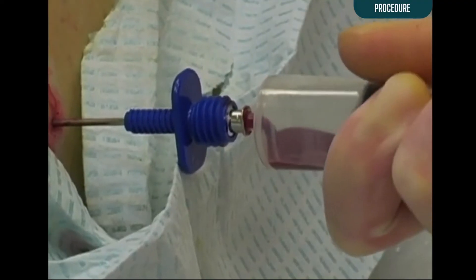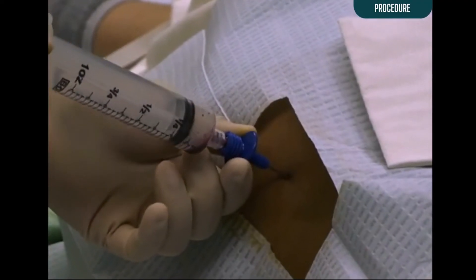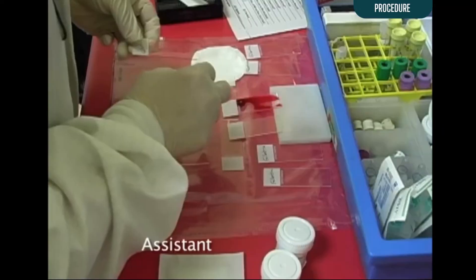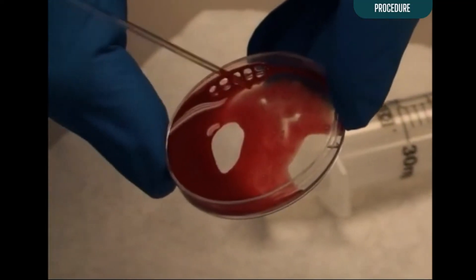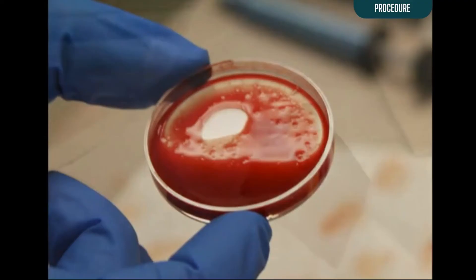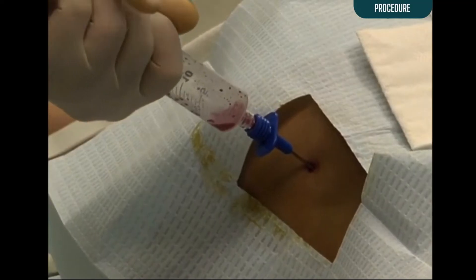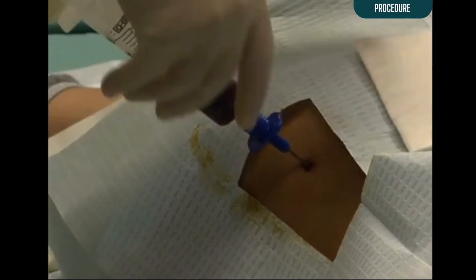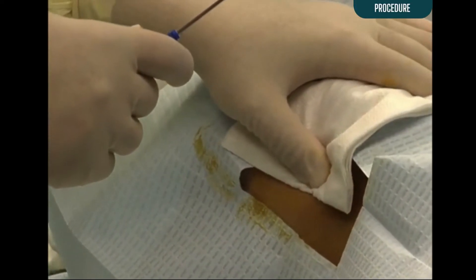Since the aspiration itself can be particularly painful, it is prudent to warn the conscious patient before you aspirate. Note that you may hand a syringe to an assistant or pathologist, taking care to maintain sterility. The non-heparinized aspirate should be used to prepare specimen slides. Adequacy of the specimen can be verified by the presence of bony spicules in the sample. Next, aspirate marrow into syringes containing 1 mL heparin as needed for diagnostic tests. Remove the aspiration needle and apply pressure with sterile gauze until you are ready to perform the biopsy.